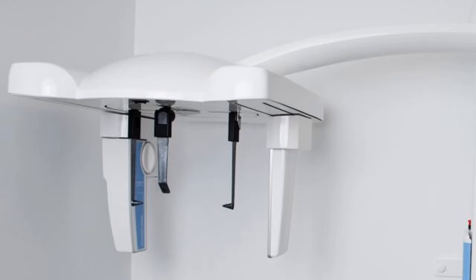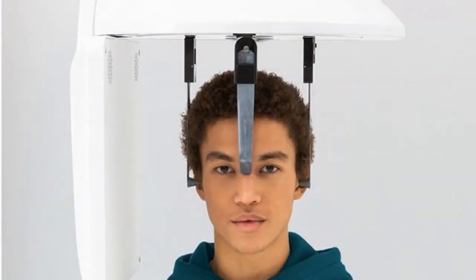The standardization of the lateral position of the head of the patient is to produce the same lateral cephalometric radiographs on different occasions, at different times, and can be taken by an orthodontist. The cephalostat is composed of two ear rods. The two ear rods are put in the external auditory meatus, in addition to the anterior rod that is put in the nasal area of the patient.